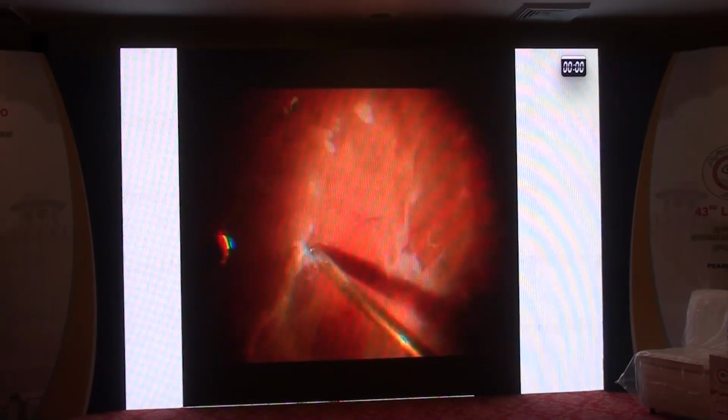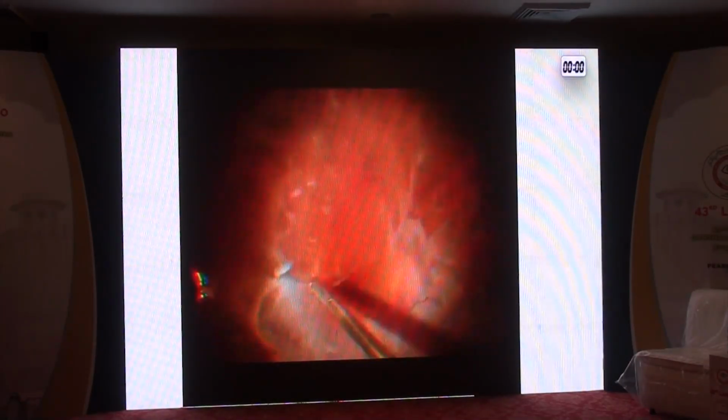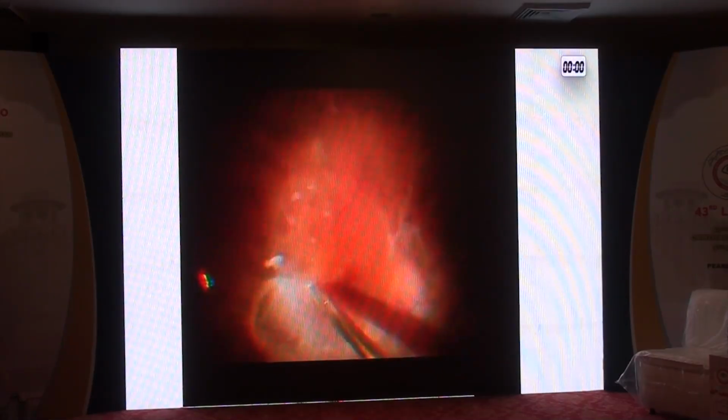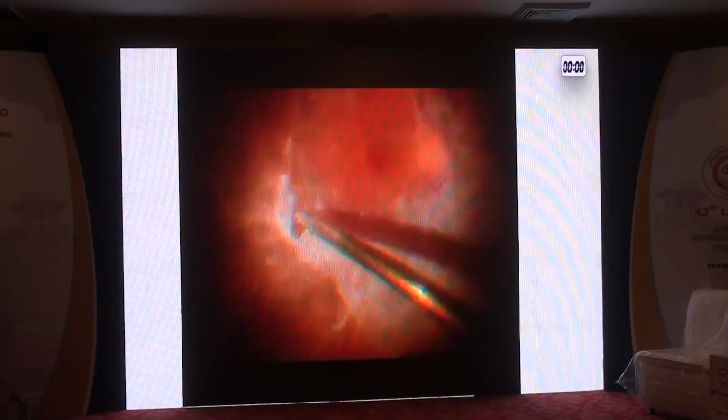If you use a higher cut rate, then FVPs don't get into the mouth of the cutter and you just end up spending more time on it. If you use a low cut rate, the retina gets into the cutter's mouth and you have a break there.